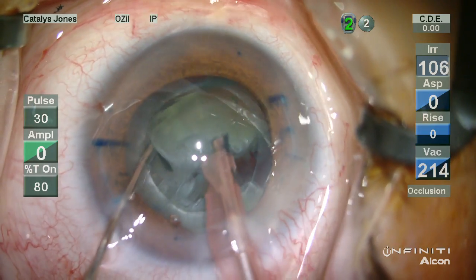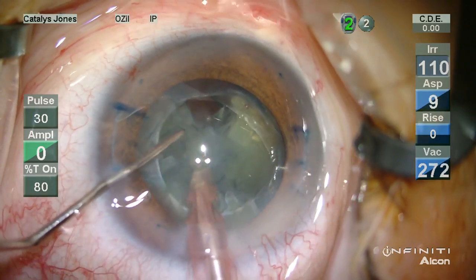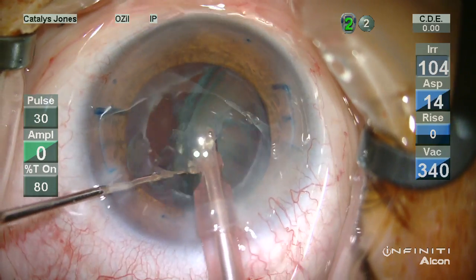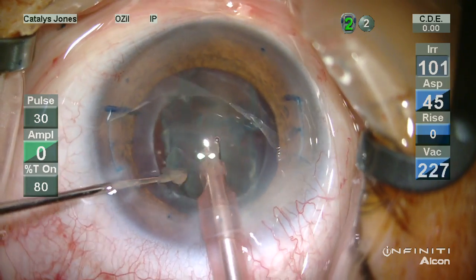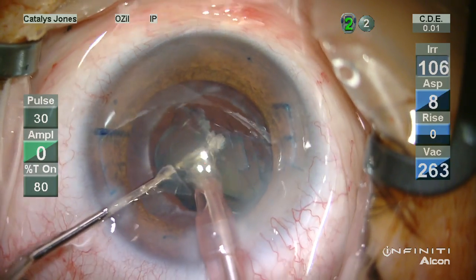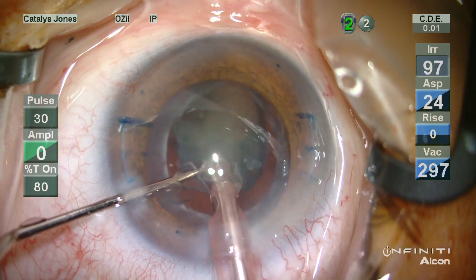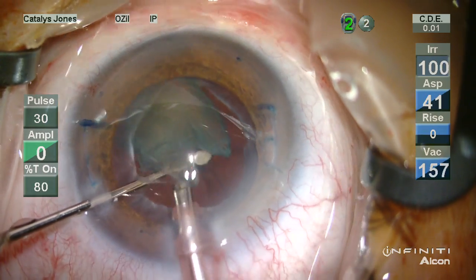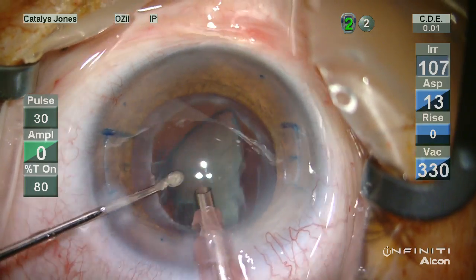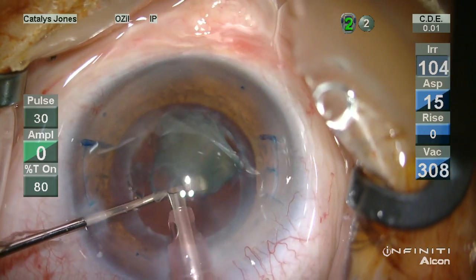As you can see, we're using close to no ultrasound energy during this cataract surgery, which is also fairly common. This patient does have a history of mild glaucoma, and fortunately the Catalys system uses a fairly low vacuum elevation for its stabilization of the anterior segment to perform both its imagery and ablation. It's a fairly quick procedure as well, so there's no labeled contraindication to a glaucoma patient having cataract surgery using this laser system.